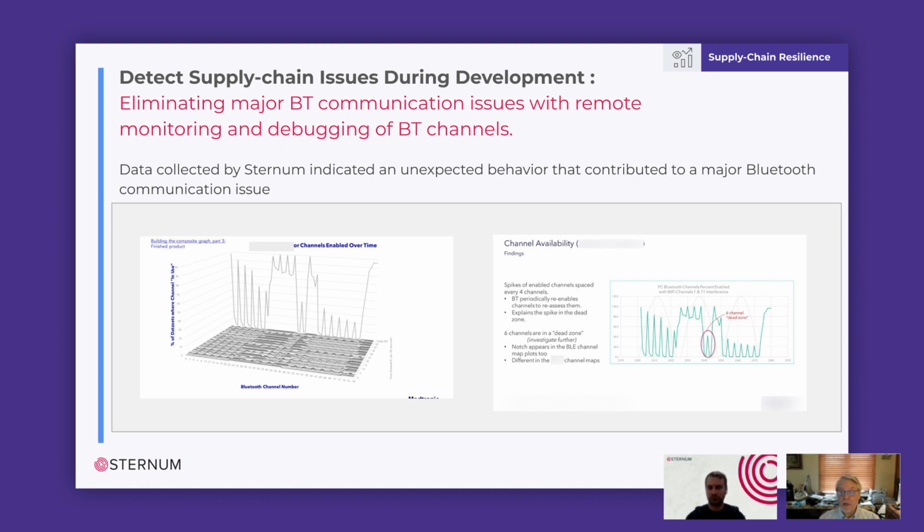And it doesn't perform as well because it's struggling with maintaining channels between two different interfaces, whereas the other piece of equipment, the base, just has that one single connection, and it's the same Bluetooth chip and the same firmware behind it, but it just gets better results in the same environment. So that was a surprise.